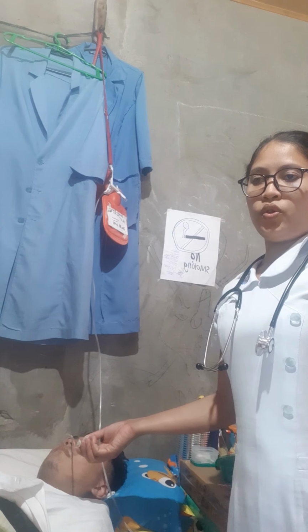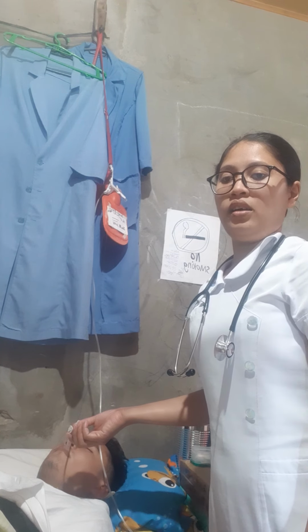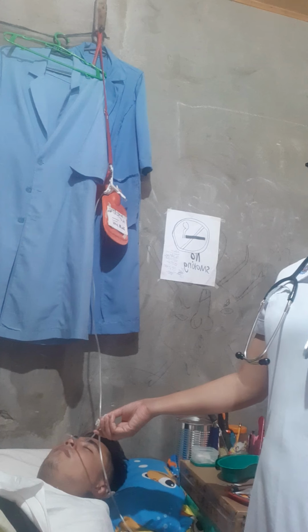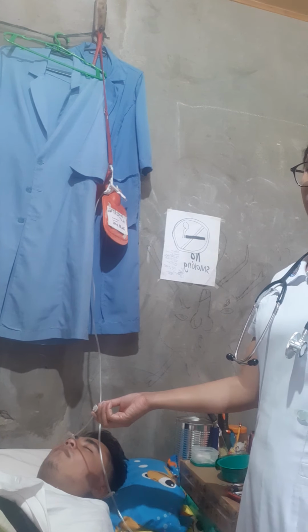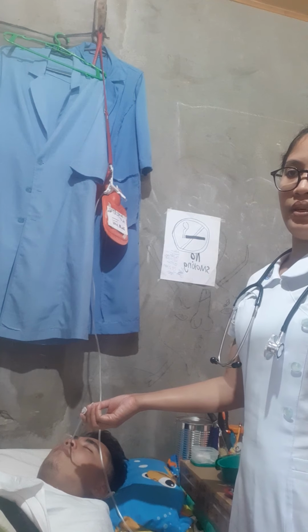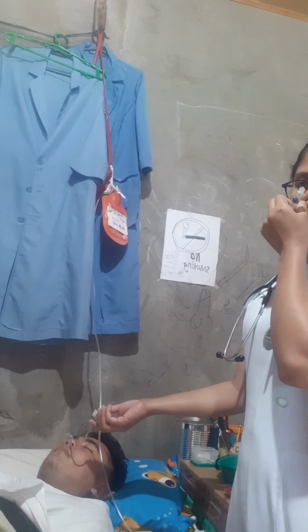Then we need to ensure that we add the water before the feeding solution has drained from the neck of the syringe or from the tubing of an administration set. Because adding the water before the syringe or tubing is empty prevents the instillation of air into the stomach or intestine, and thus prevents unnecessary distension. Then next, clamp the feeding tube before all of the water is instilled.